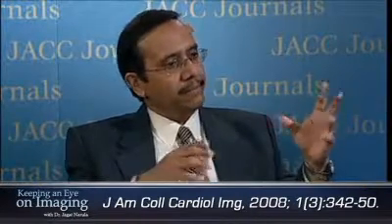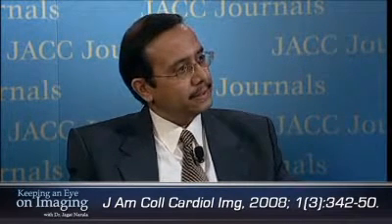Dr. Lindner, in a brief capsulated form, tell us how the technique is done and can an average lab do it? Yeah, I think one of the beauties of the technique is, number one, it requires machinery that's in place in most vascular labs, which is an ultrasound machine which is contrast ready. We begin an infusion of our microbubble contrast agents, and I must state that this is an off-label use of microbubble contrast agents. But we begin a continuous infusion of these agents, and we measure perfusion at baseline. And using some of the more modern real-time techniques for measuring perfusion, that only takes about 15-20 seconds.